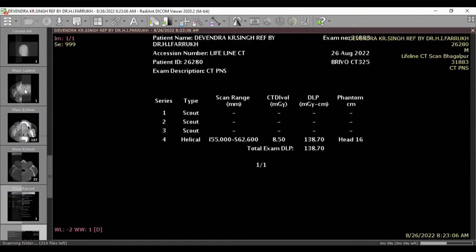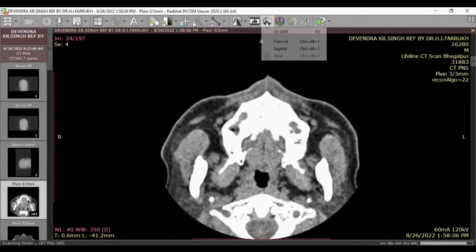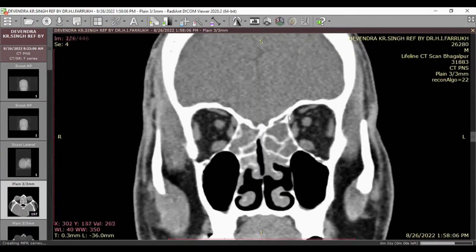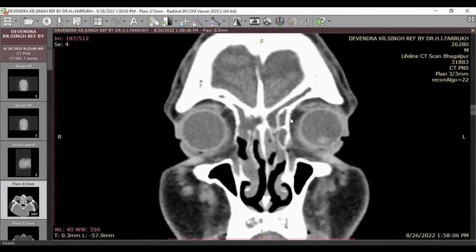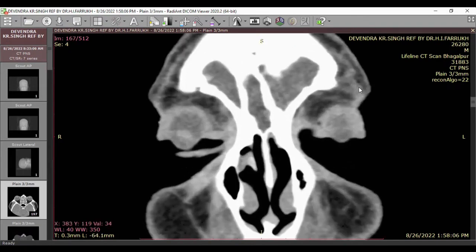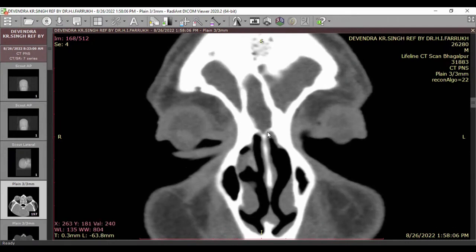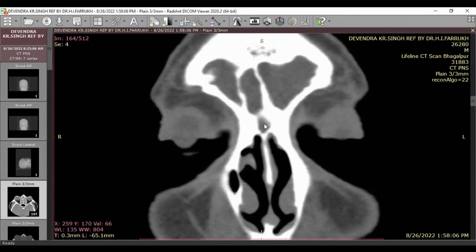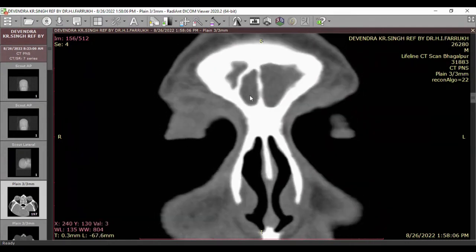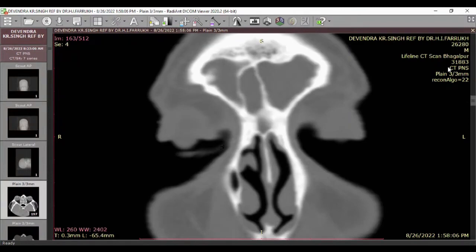See this particular patient, if I reconstruct, see this. I remember this patient had a huge intersinus septal cell. And see where it is communicating. It looks like 3 frontal sinuses. Where the actual frontal sinus is, see, is the beak.